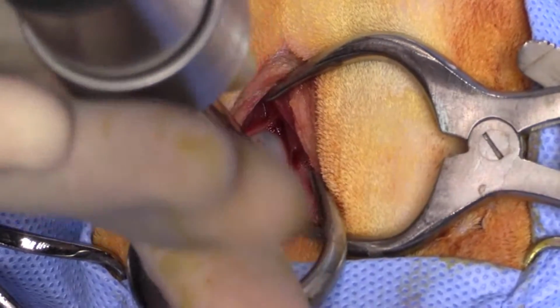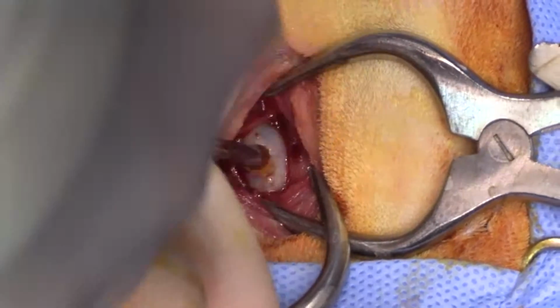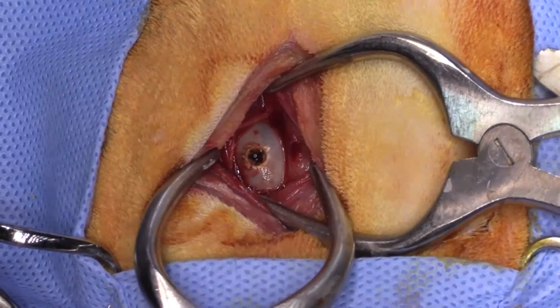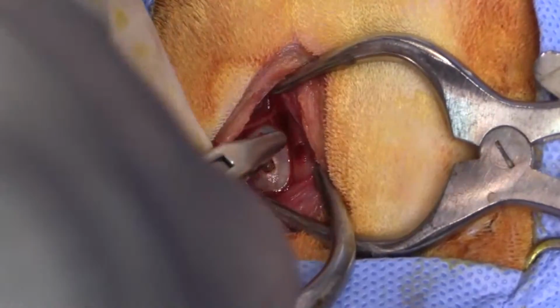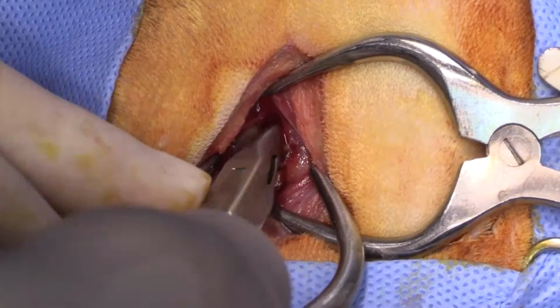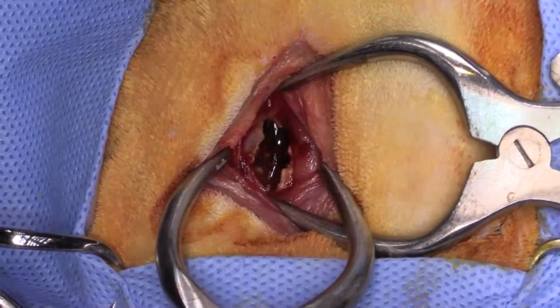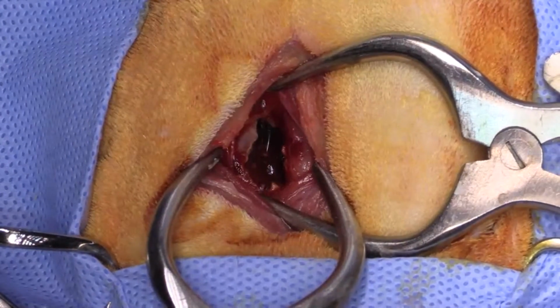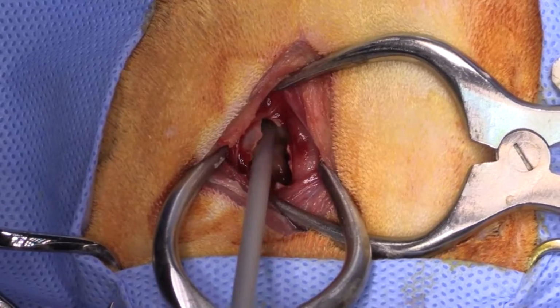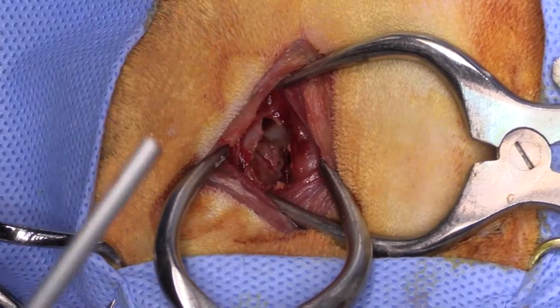And I'm drilling into, and again, this is the ventral medial compartment. And then I'm going to use my Lampert rongeur to expand that osteotomy. Some nice mucoid material. It's a little bit more rust colored, probably a bit more hemorrhage on this side. And we'll just suction all of that out. And I can actually see the polyp on this side really clearly. And I've just suctioned it out.